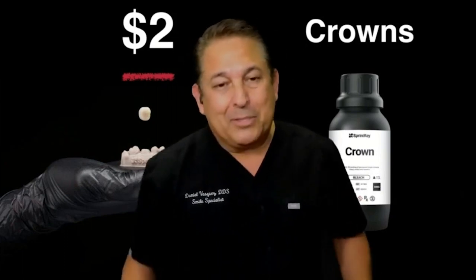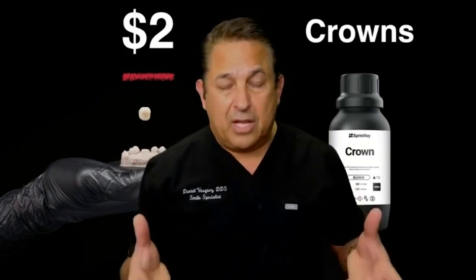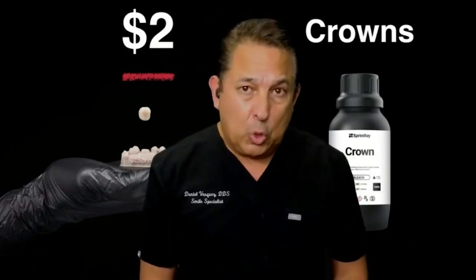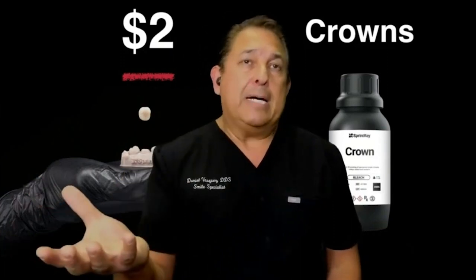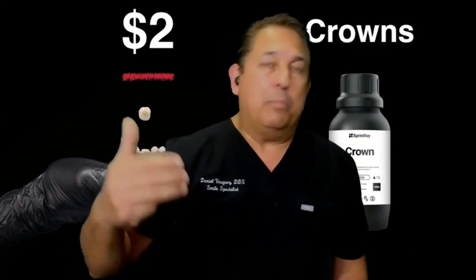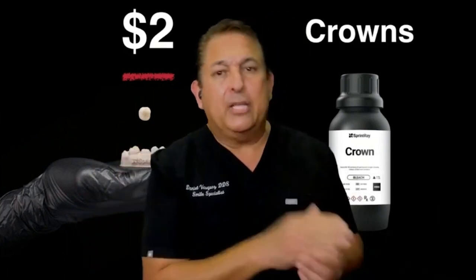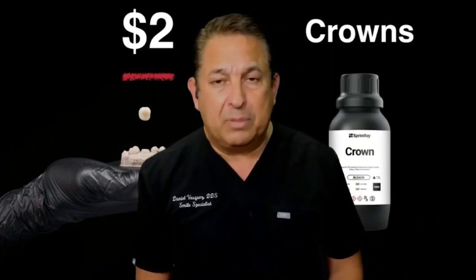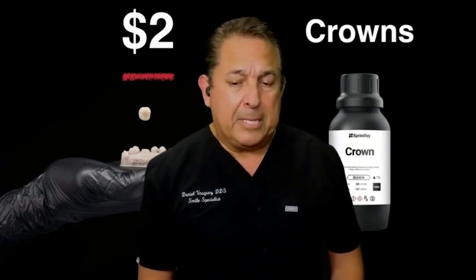But yes, it costs about $2 to do a crown, and it takes about 35 minutes to print today. Literally, today, your crown is at your side. If you have the lab software in your office, and you can scan, design it, and print it, it's just great. If you don't have the power of printing today or milling, then you scan and you send it to your favorite lab. They can design it for you and they will send back the STL for you to be printed. So there are many ways you can do this.